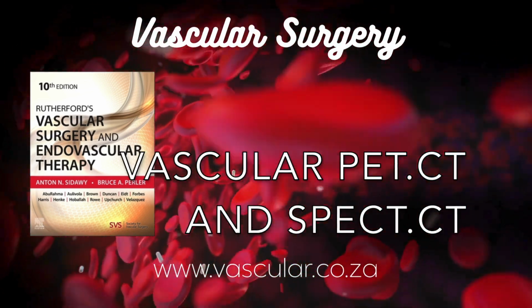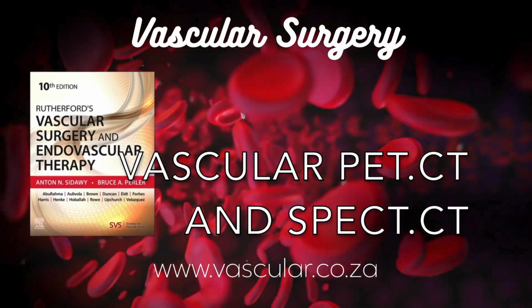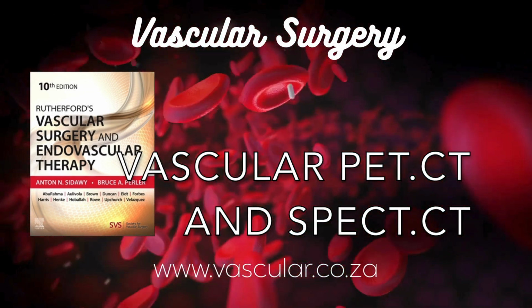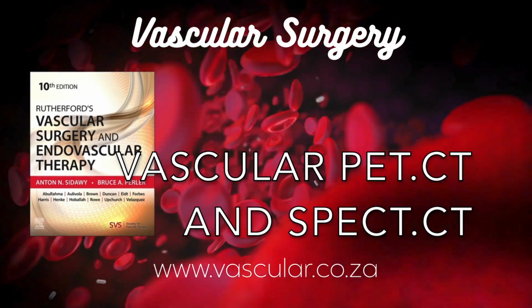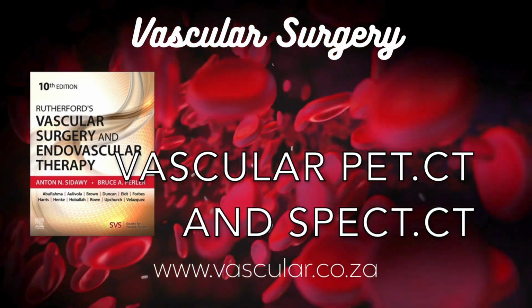Also, as we touched on, some tracers, especially older SPECT agents, have issues like slow blood clearance or nonspecific binding, making the images less clear. Finding that perfect tracer for routine vulnerable plaque imaging remains a hurdle. So still some technical hurdles and tracer development needed for widespread use, especially for vulnerable plaque. Yes, particularly for routine clinical decision-making based solely on these scans for plaque.